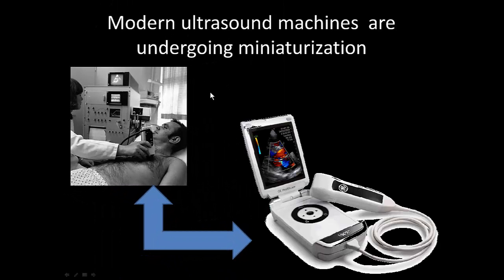Nowadays, if you compare the size of an ultrasound scanner back in the 60s or possibly 70s to what they look like today, you can see everything's undergoing miniaturization, and as technology advances, we are able to cram more and more technology into these little devices and make them much more powerful in what we can do with them.